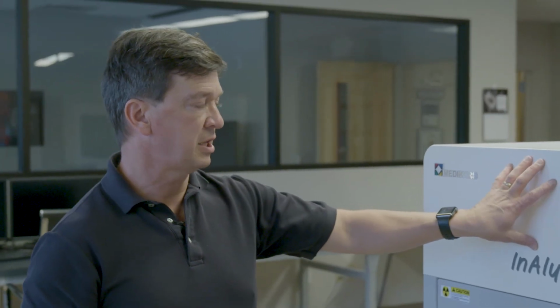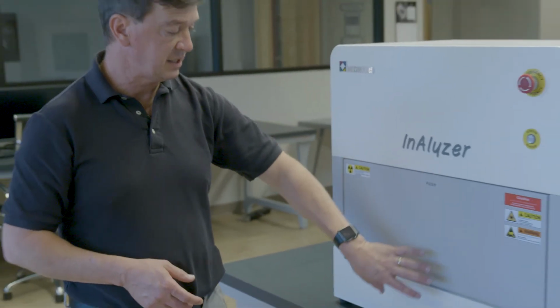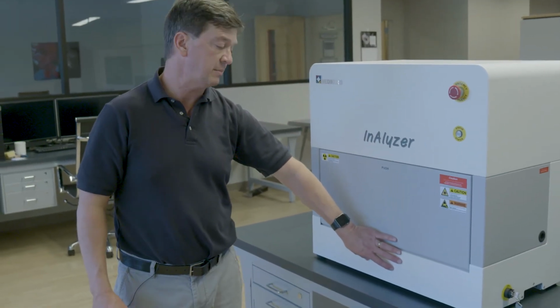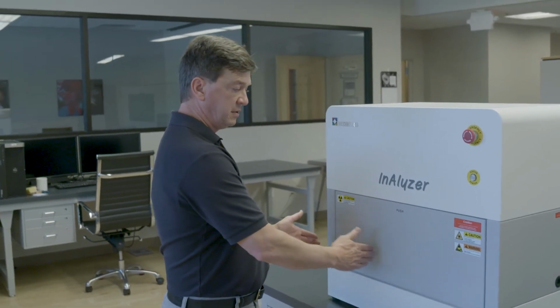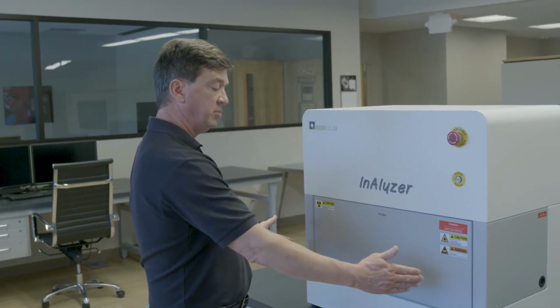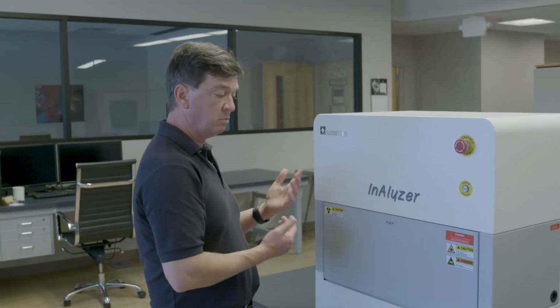There's an X-ray source on top. The X-rays pass through the animal, which is encased here, and it goes down to the detector, which is on the bottom. It's a linear detector, so what we do is it starts here, goes over, scans the animal, comes back, changes energy, and does it again. And once it's done, we can open the door and take it out and move on to the next animal.